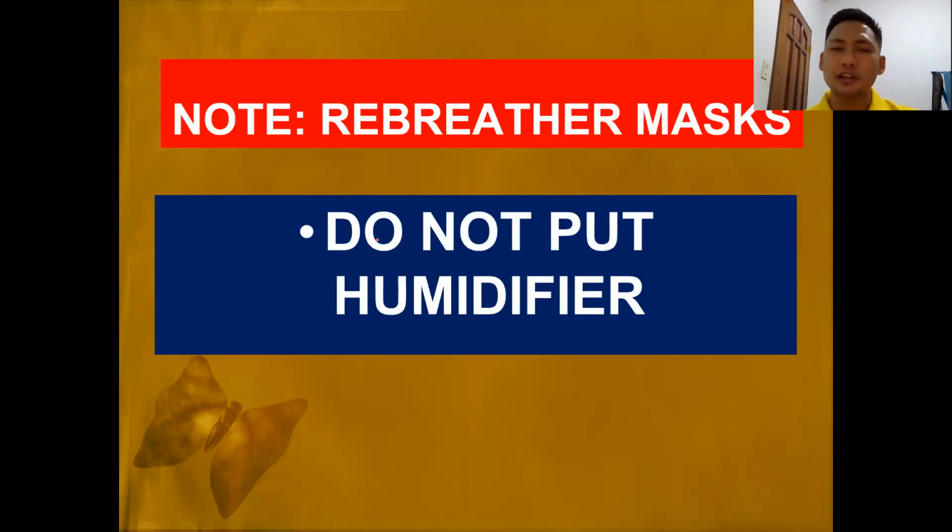Why should we not put a humidifier? Because, of course, rebreather masks should not be used in long-term oxygen therapy for your patient. So we just need to reassess.